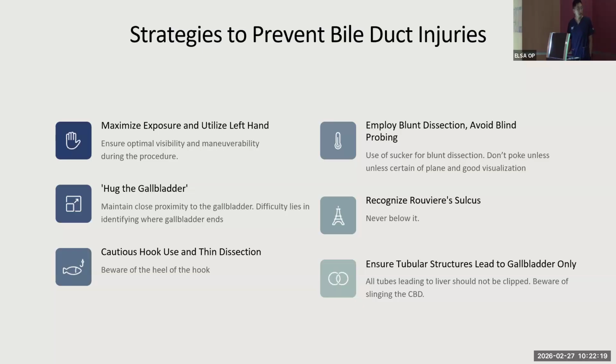Okay. And the third thing, cautious use of the hook. The heel of the hook, I always tell residents, is not to touch any structures. A lot of times the hook goes in and the heel and the angle of the hook is still touching the back end of something else. So you don't know what it is. So I always emphasize that the hook should be out completely, and the back of the heel is not touching anything else before the burn is done.